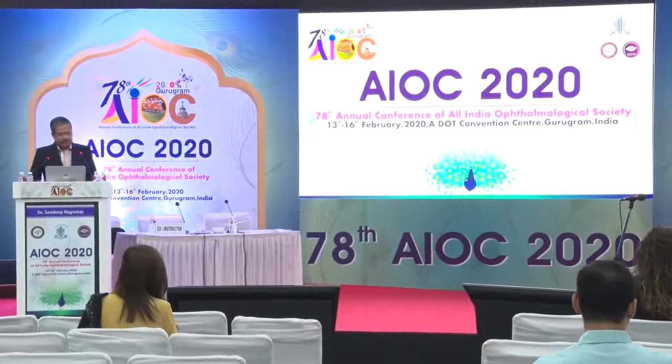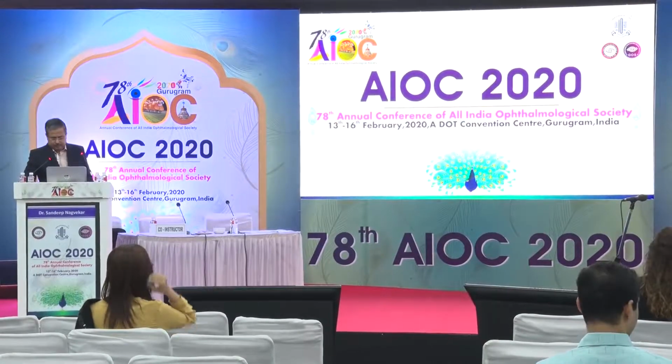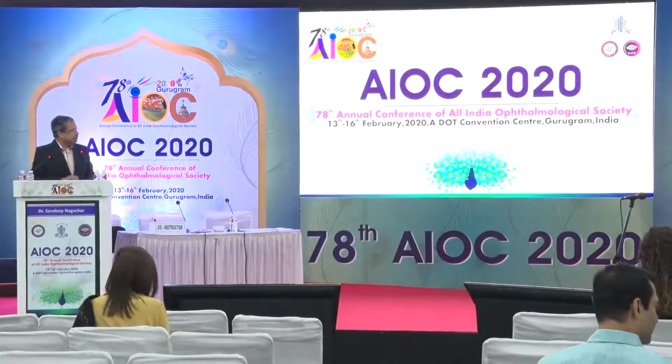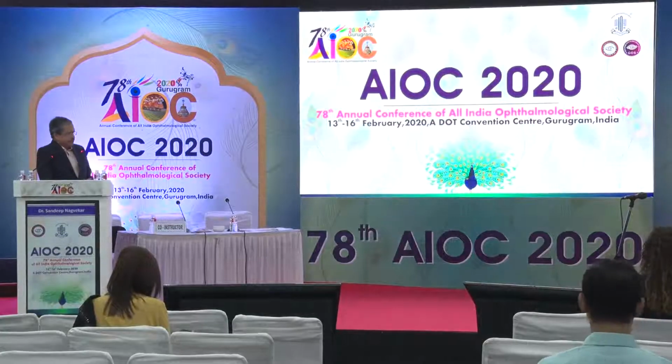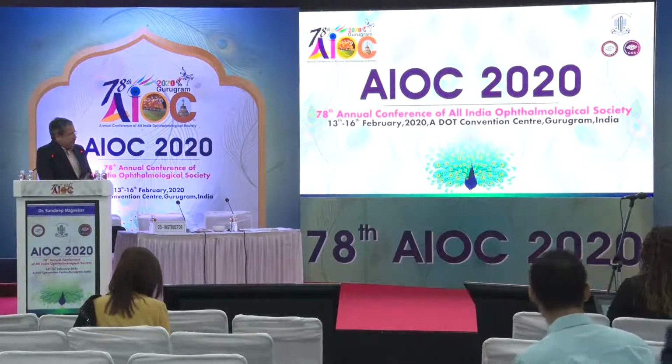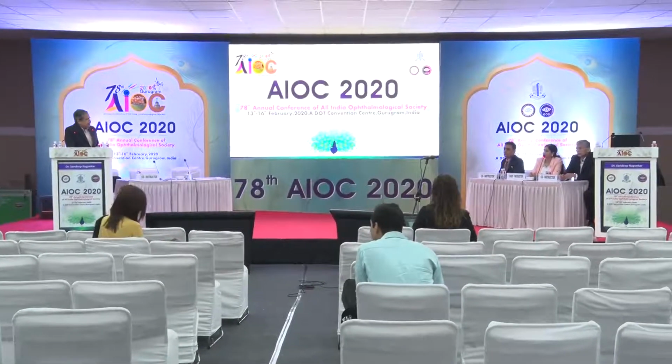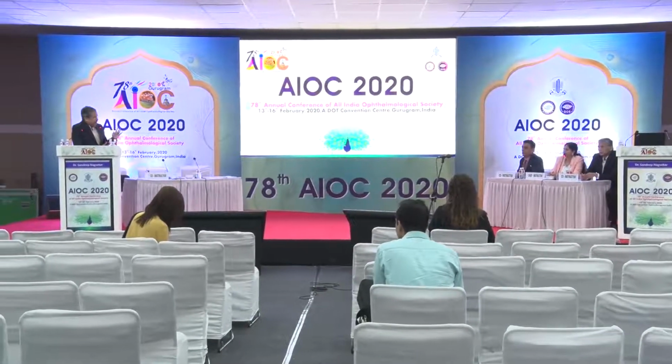Thank you very much, Dr. Sandeep Nagvekar. Actually, one more thing I wanted to ask you regarding the rhexis. Any specific preference for a slightly larger rhexis in these cases? I always attempt a larger rhexis. About between 5 to 5.5 millimeters is my choice of rhexis. I won't go larger than that. Not larger than that, but about 5.5.